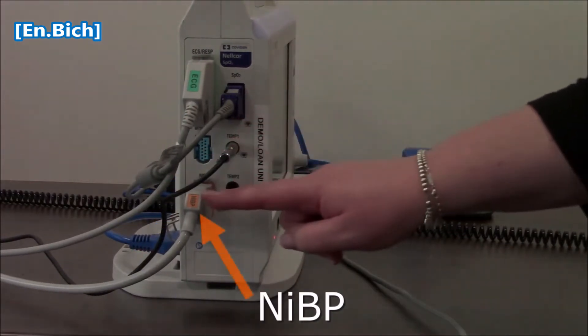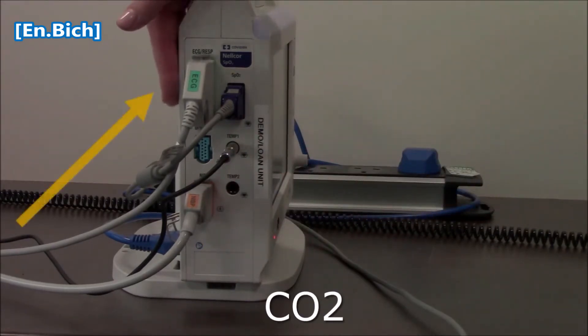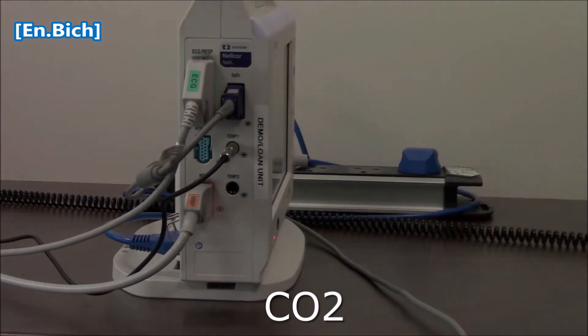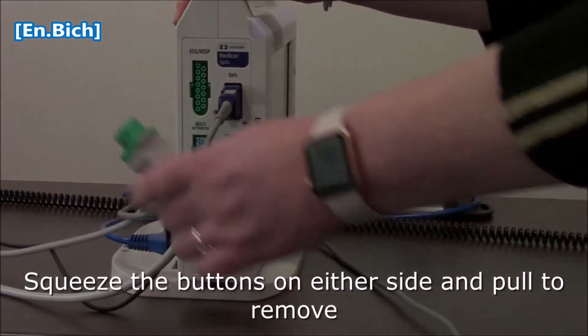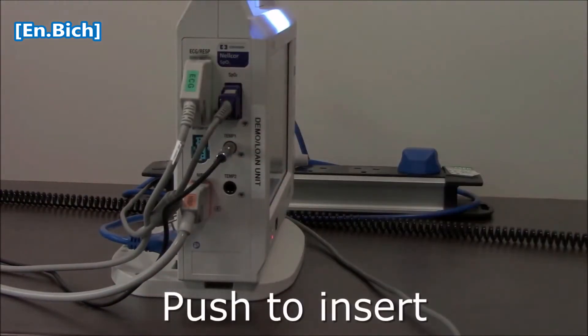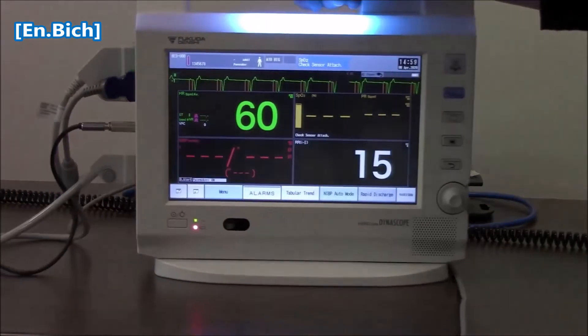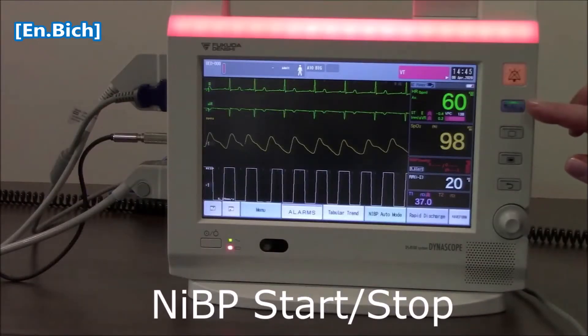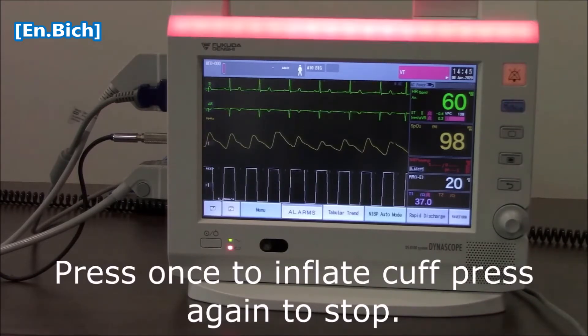This is also a temperature port, non-invasive blood pressure, and some of your monitors may have the CO2 module that will be here. To get any of these in or out, you simply squeeze and pull, and push in in order to put the cable back in. This will light when pressed, and you'll also be able to hear it inflating your cuff. If you need to stop it for whatever reason, just press again and it will stop inflating.